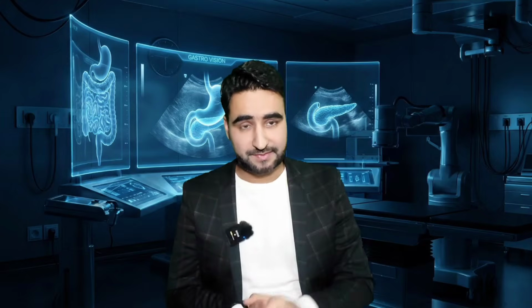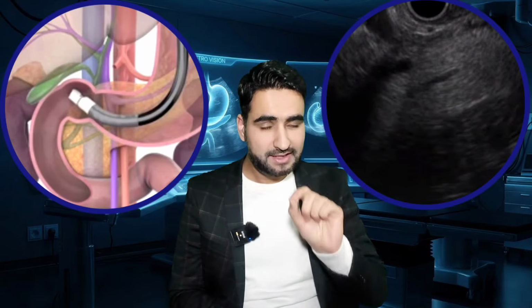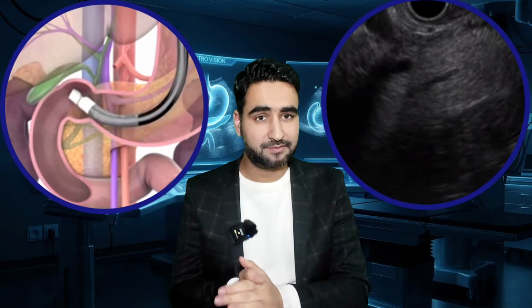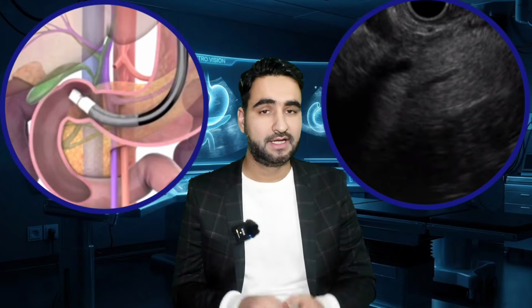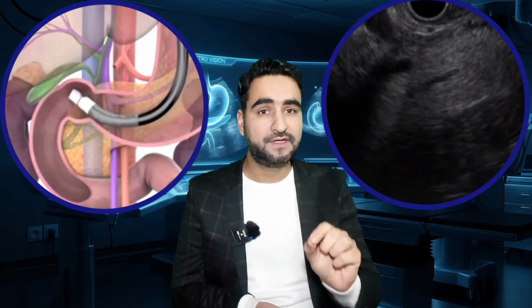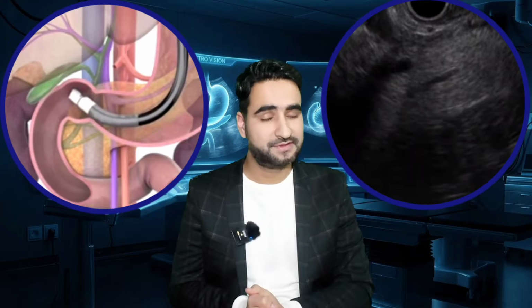From the confluence, perform slight clockwise rotation. What comes into view? The neck of the pancreas with the main pancreatic duct clearly visible. Initial clockwise rotation is from hilum to confluence. It helps to trace the portal vein from liver hilum down to the confluence. You are sweeping from superior to inferior. Further clockwise rotation at the level of confluence. Now the field of view shifts from posterior to anterior. Why? Because of the three-dimensional geometry of the structures.